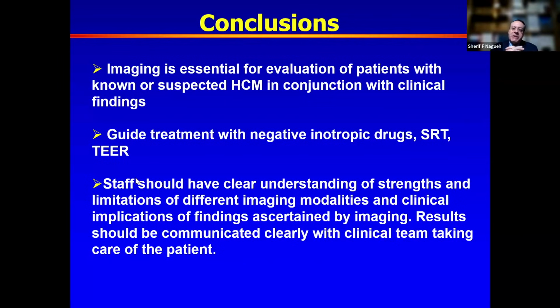So this can add a lot of confusion to the situation and poses management challenges. It is best to use the same state on follow-up at least. And if we do a postprandial study at baseline, we want to do a postprandial study when we do follow-ups for these patients. And the lab should provide these instructions. Yes.